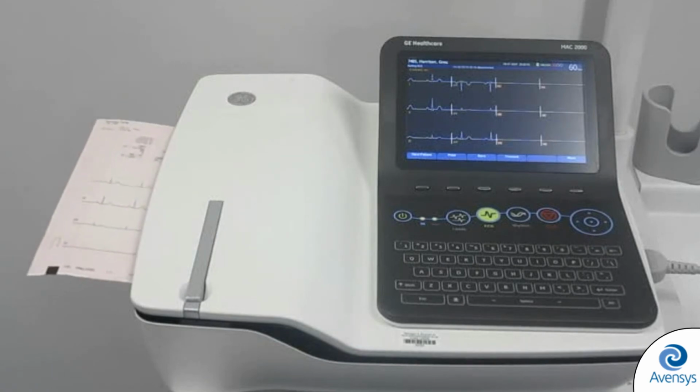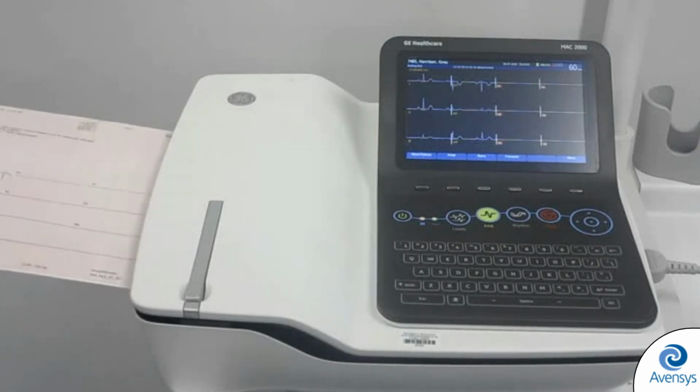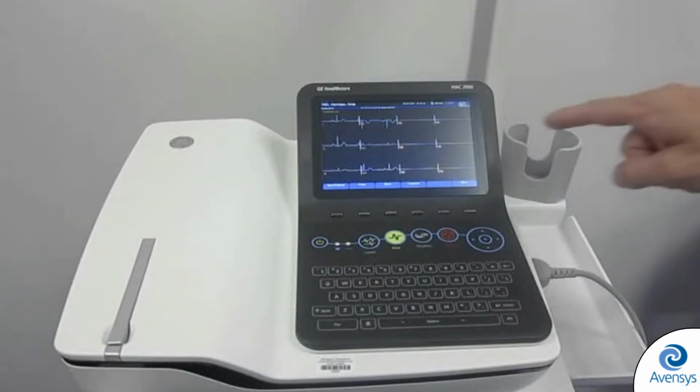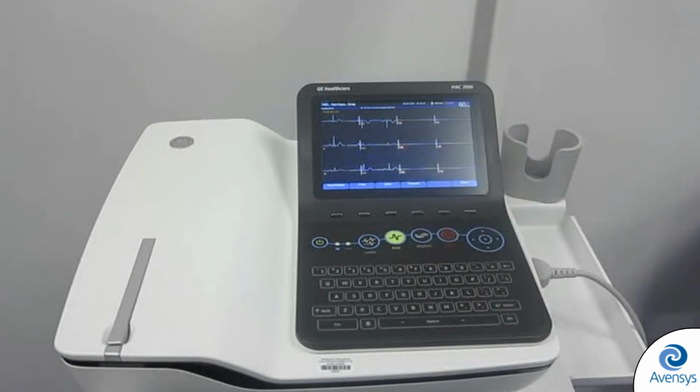Otherwise, press the Cancel soft key and then press the ECG key on the keypad to reacquire the 12-lead ECG. Pressing the Save soft key will store the ECG. For further ECG setup options, please see the operator's manual.